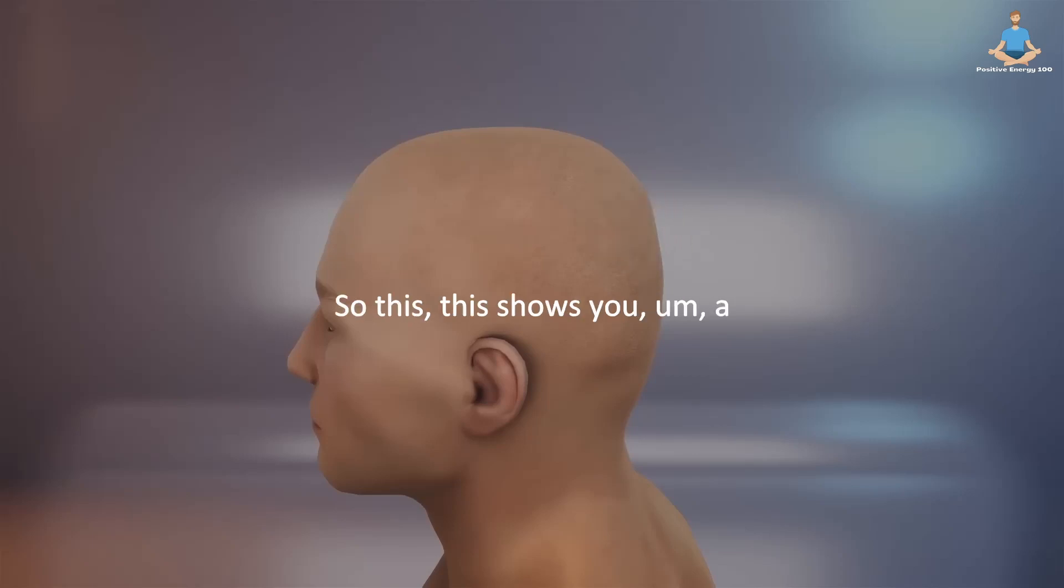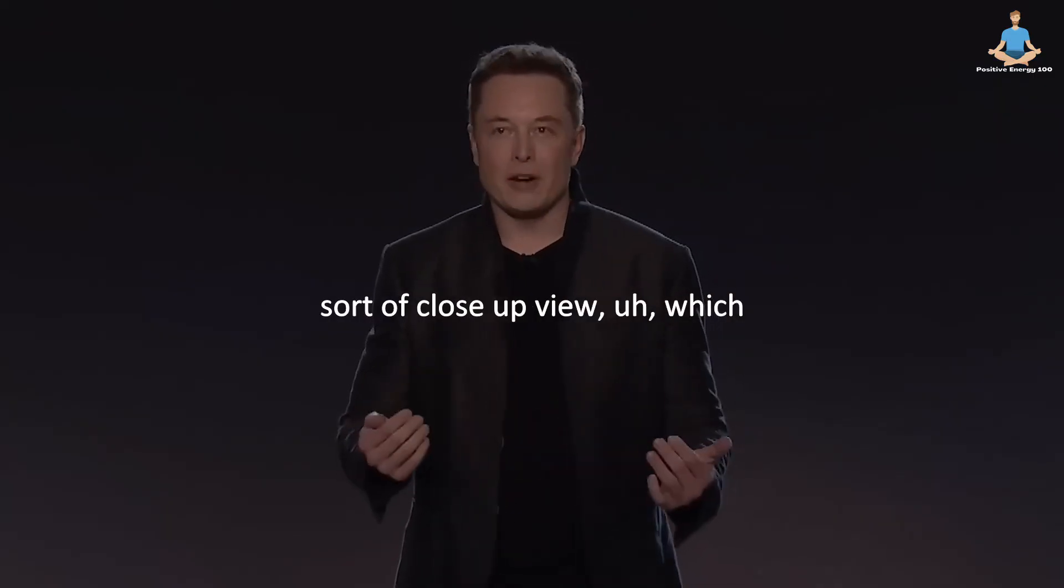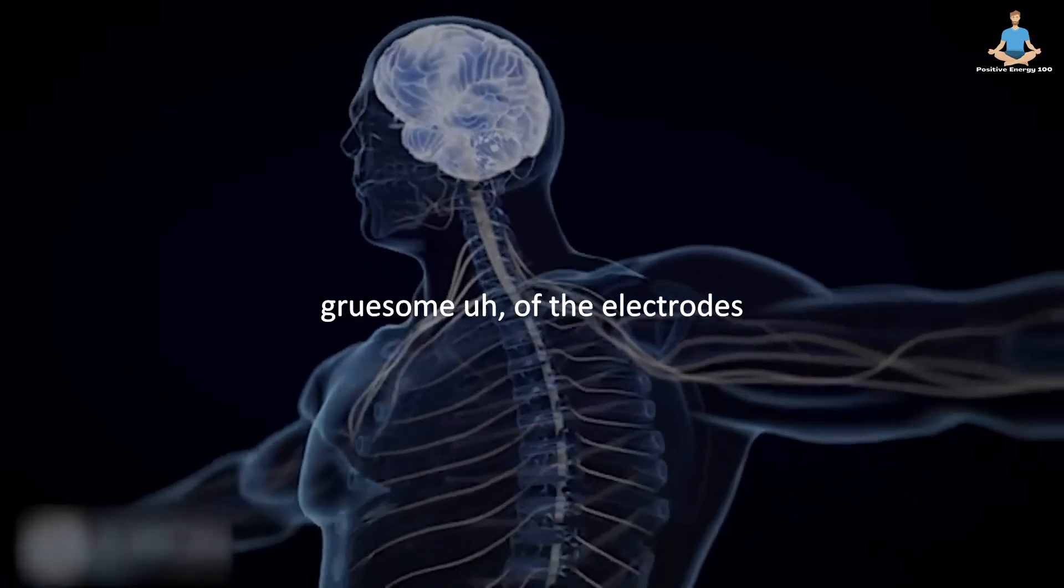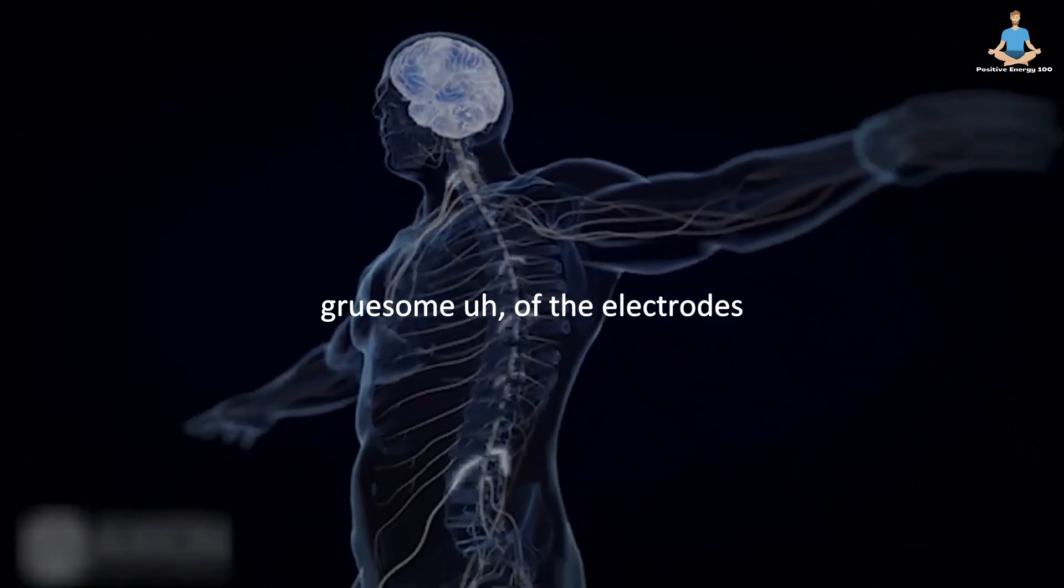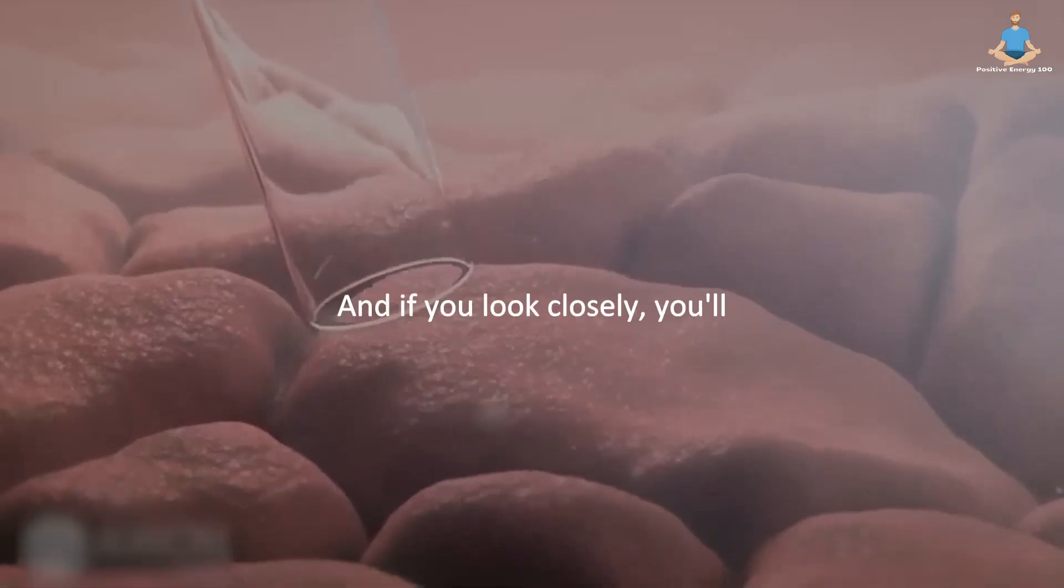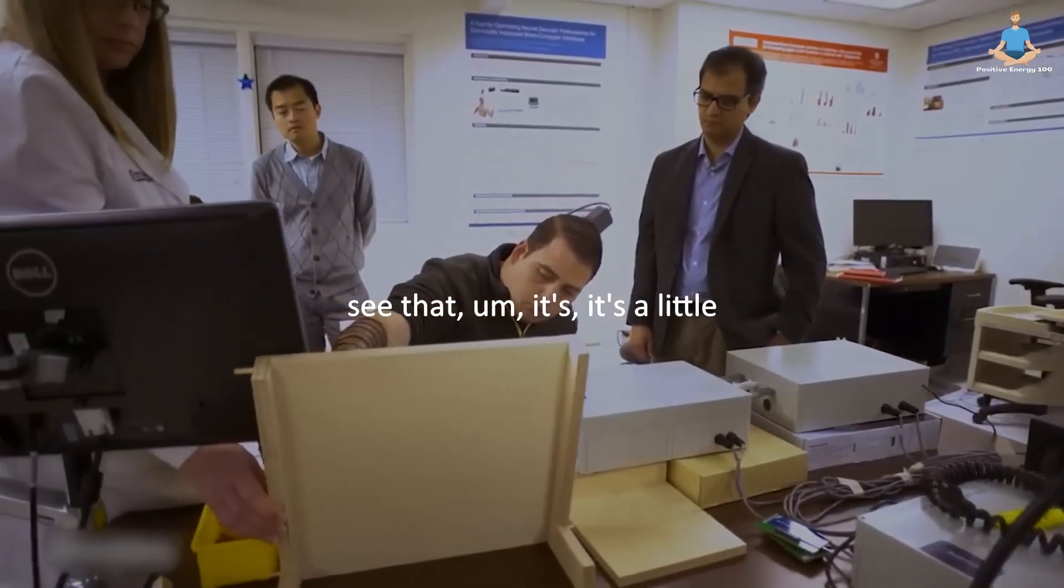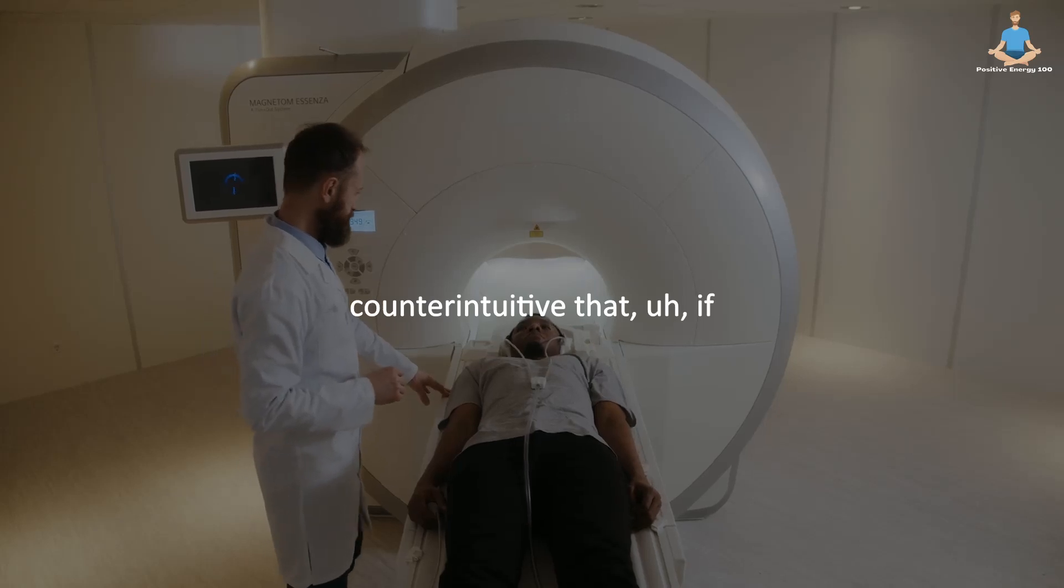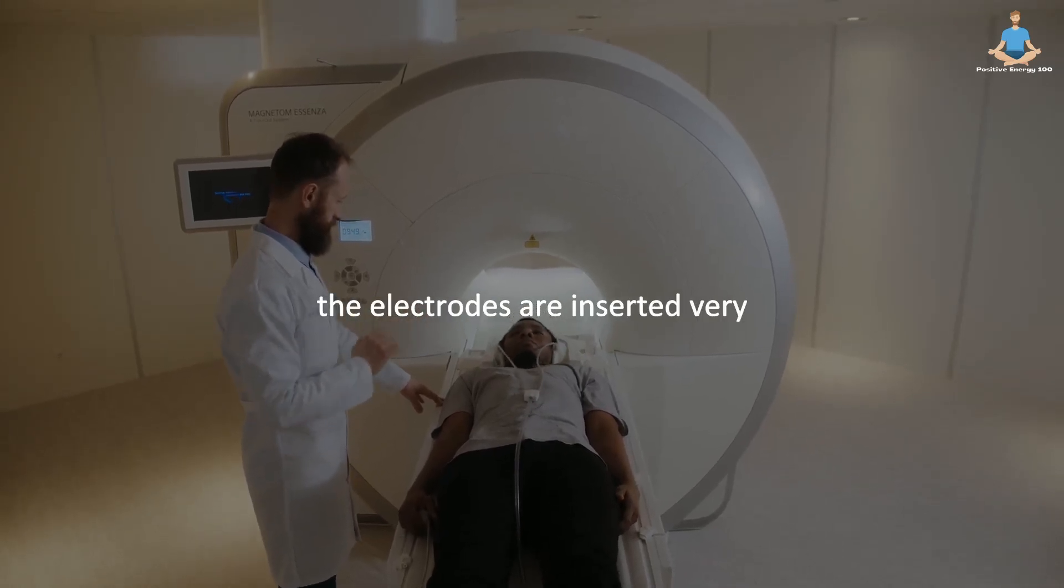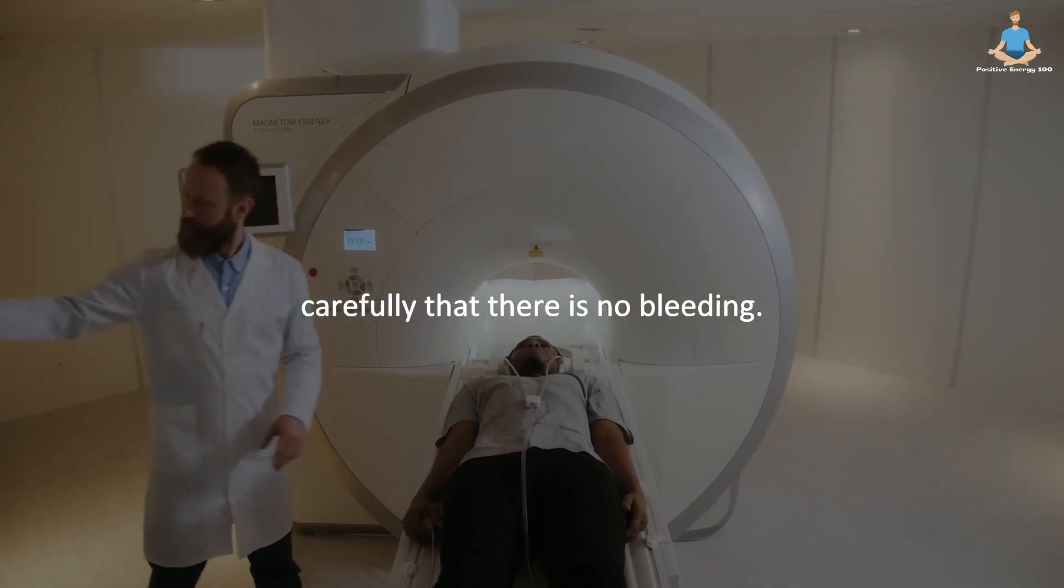So this shows you a sort of close-up view, which I think is actually not too gruesome, of the electrodes being inserted in the brain. And if you look closely, you'll see that it's a little counterintuitive that if the electrodes are inserted very carefully, that there is no bleeding.